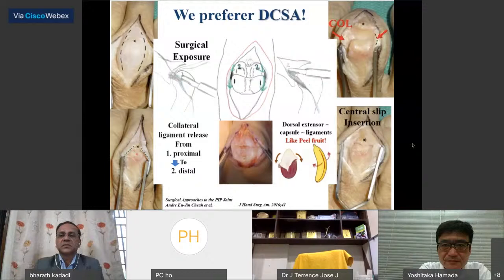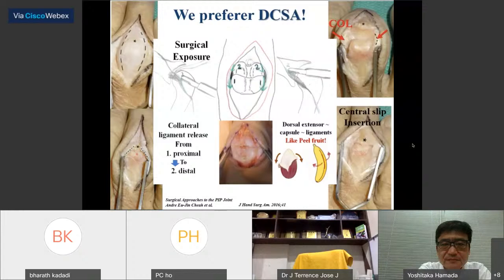Serial release started from the dorsal tendon to joint capsule, including collateral ligament, and was sharply incised down to the periosteum using a blade from proximal to distal. The joint was then exposed by elevating the central tendon, including capsule, into flaps radially and ulnarly. Although stable COL is not necessary, we try to preserve the longitudinal elements.